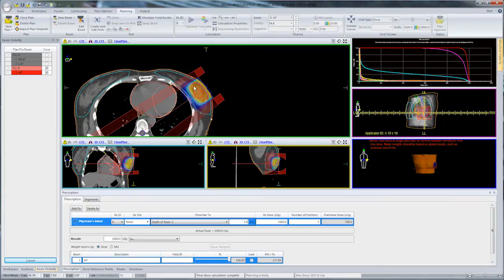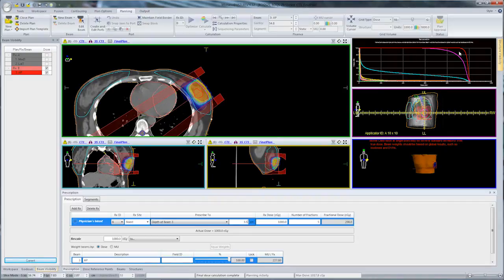Now we've got better coverage. We can see on the DVH that the GTV is uniformly covered. If we want it to go even higher, we could make that perhaps 4 centimeters.